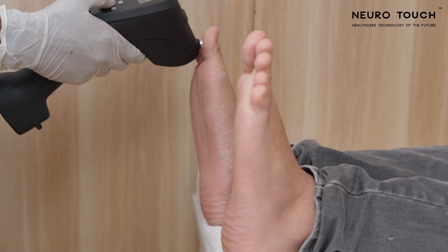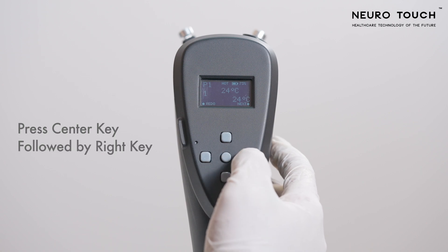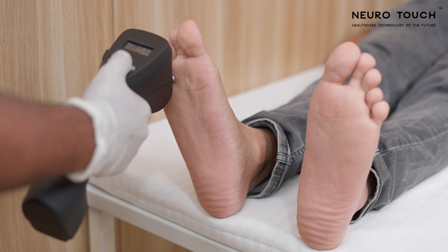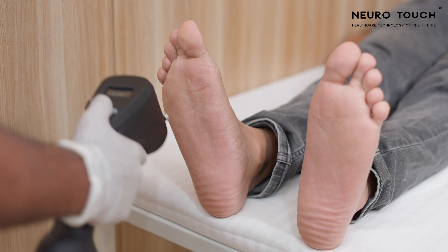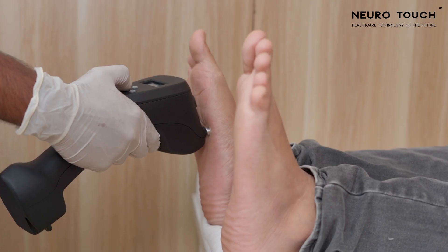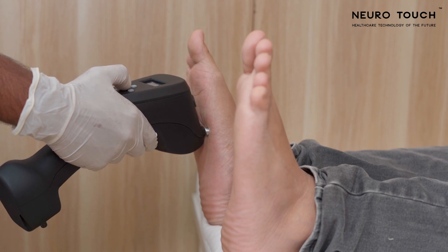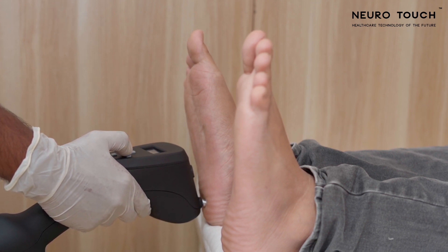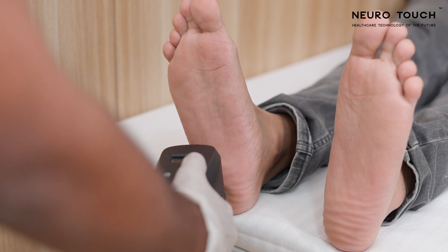Place the hot probe against the patient's test point and take feedback from the patient. The patient should perceive mild warmth when the probe is placed against the test point. Hold the probe against the test point for approximately three to five seconds, as it takes some time for the patient to perceive the warmth of the probe.